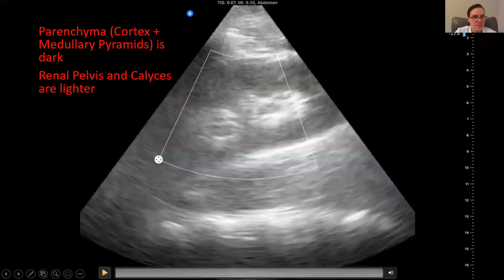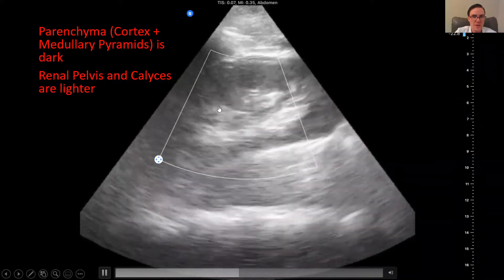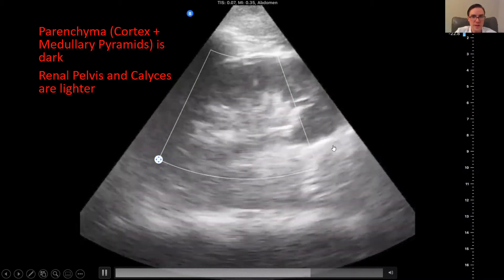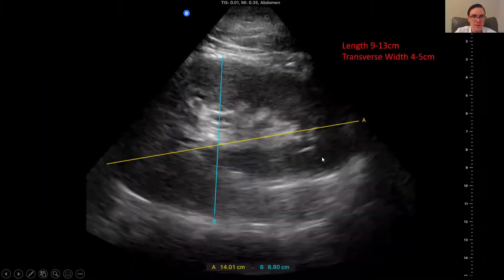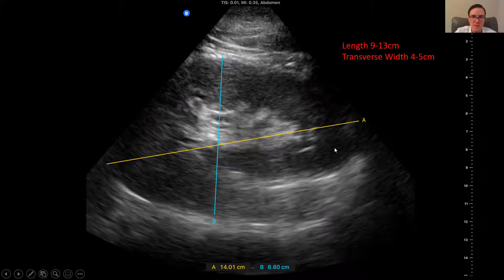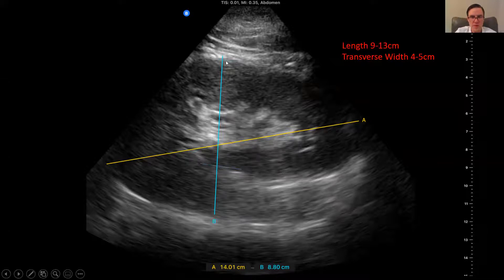Looking at some images: the parenchyma is dark, and inside, the renal pelvis and calyces appear much lighter — that's where you'll be measuring. For the full kidney measurement, you want to measure the length from end to end, which here is about 14 centimeters — a little bit bigger than average. The measurement shown by the ultrasound tech was done incorrectly; a more correct measurement from the proper landmarks is closer to about five centimeters, which is closer to the normal range.